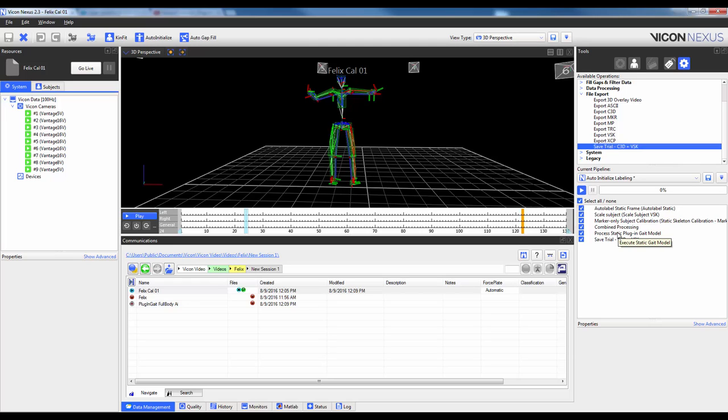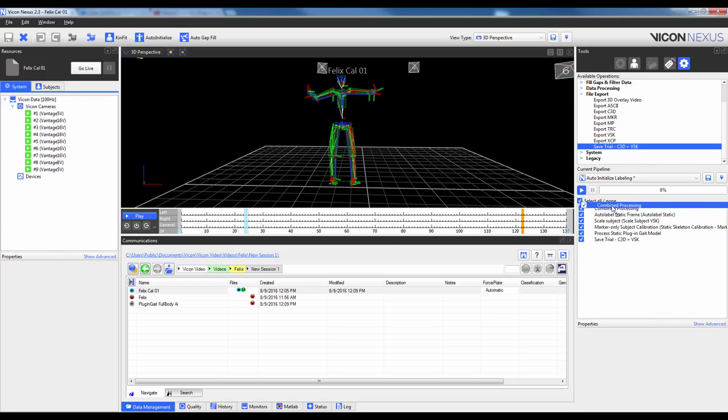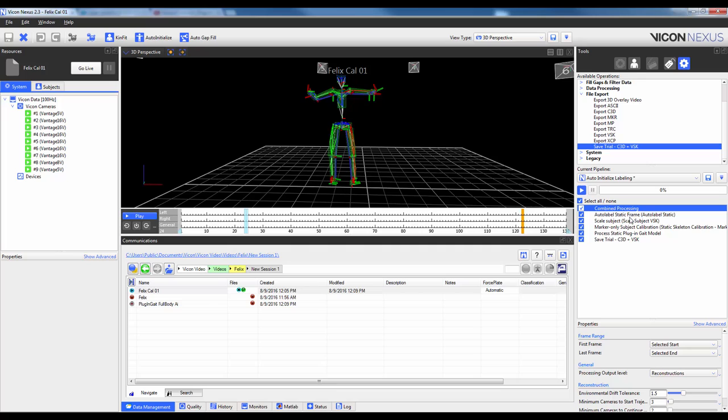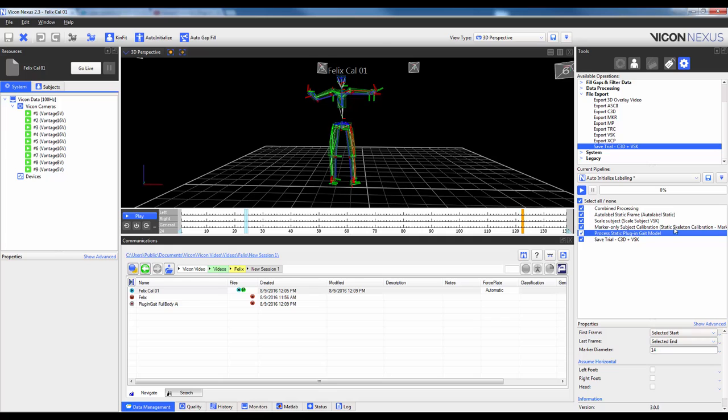I'm then going to just reorder it so that reconstruction will actually be first, the combined processing. So that's up at the top. I'm going to highlight combined processing and just make sure that the processing level is actually set to reconstructions. Then I'm going to have three steps of auto-initialize. Then I'm going to have it process the static plug-in gate model. Again, if you need to, go ahead and change any of the settings here. Then I'm going to have it save the trial.